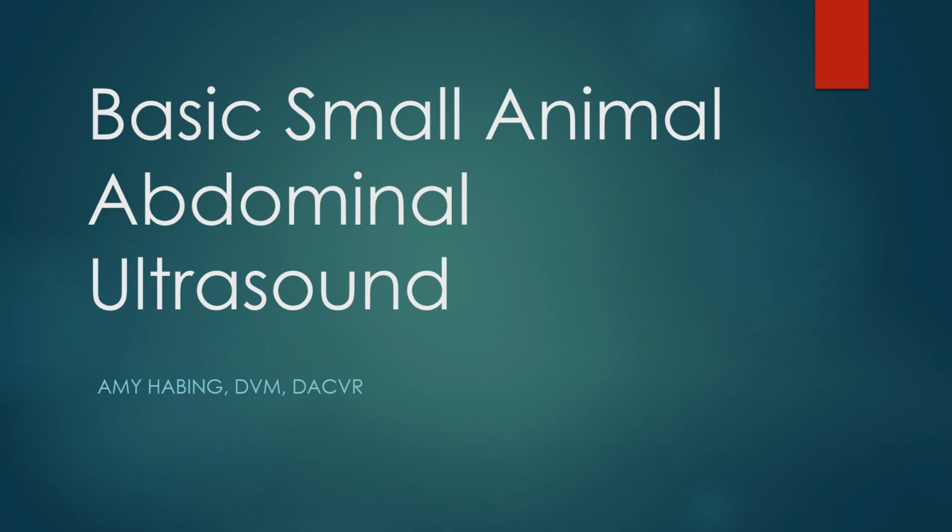Hi guys, this is Dr. Habing. This presentation is going to be a pretty short introduction on abdominal ultrasound in our small animal patients. We are going to just cover the basic large organs, how to find them, and how to recognize them.